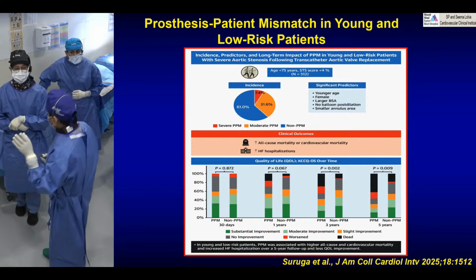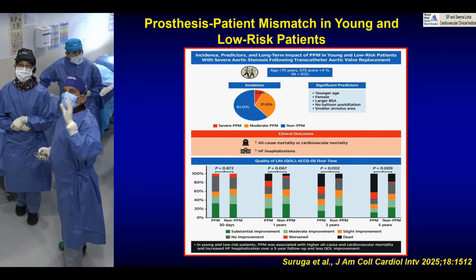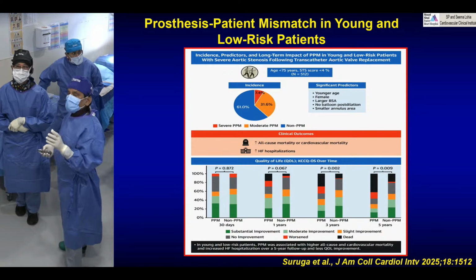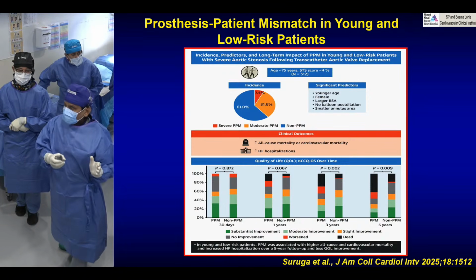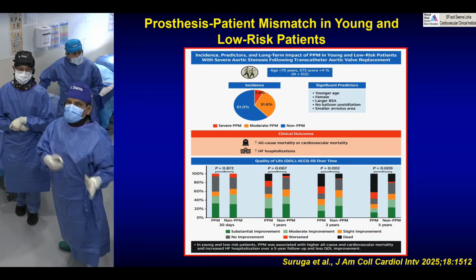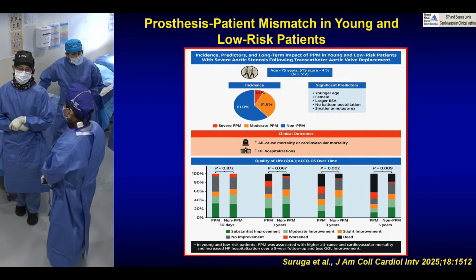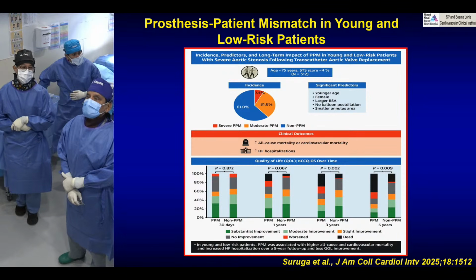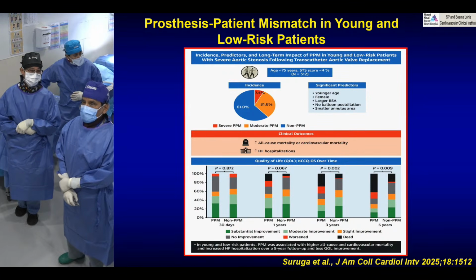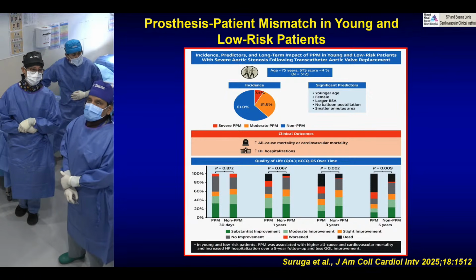So I think the second TAVR, maybe in young people particularly, will be able to decrease the patient-prosthesis mismatch. Now, the only question is whether you can use a bigger valve versus a smaller valve at time zero in these patients. So that's always a question to make. Right, the issue is a bigger valve. We've seen in a previous paper that it's underexpanded and a precursor for HALT and degeneration. So it's not necessarily better by putting a bigger valve in.